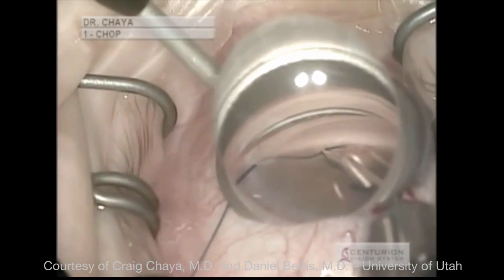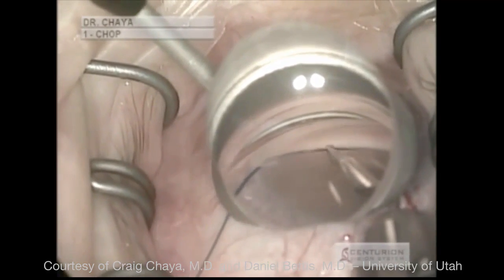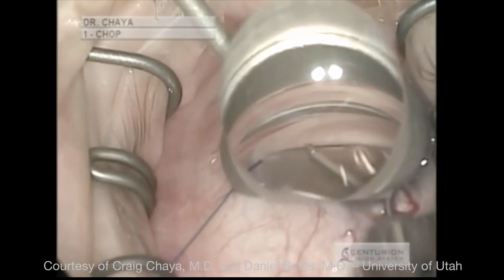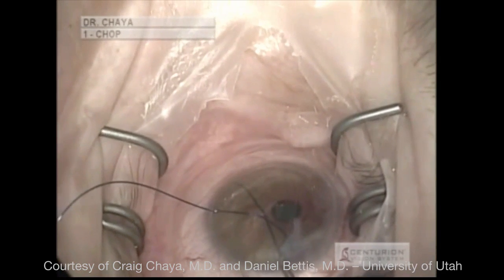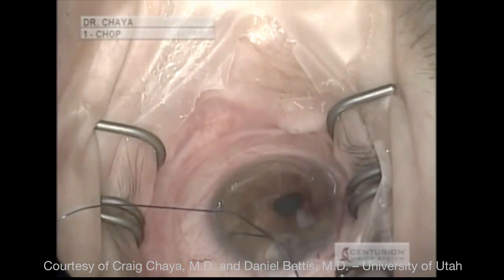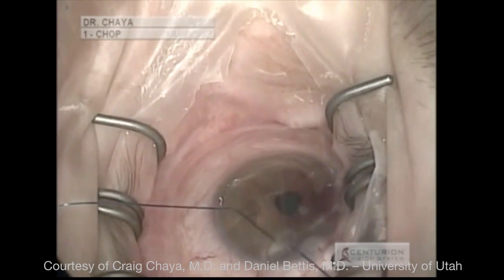A suture is inserted into the canal and threaded 360 degrees around. Once completed, the two ends of the suture are grasped and the inner portion of Schlemm's canal is torn through — essentially a 360-degree trabeculotomy. The big advantage is there's no conjunctival dissection and no need to find Schlemm's canal through the sclera. It's a very elegant new procedure, and with all of these we need to understand the efficacy of each and how they compare against other glaucoma procedures.